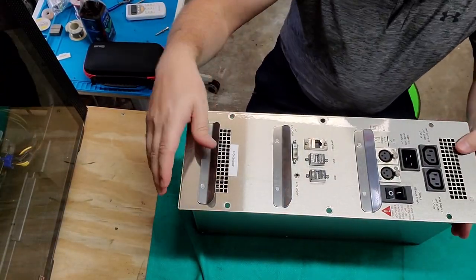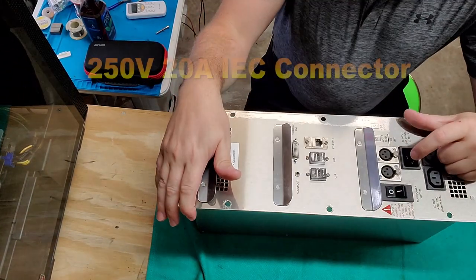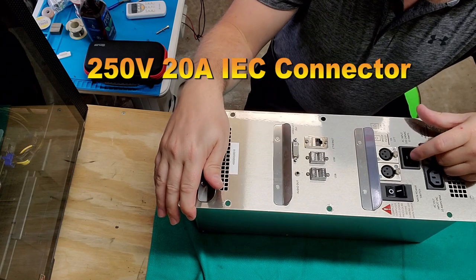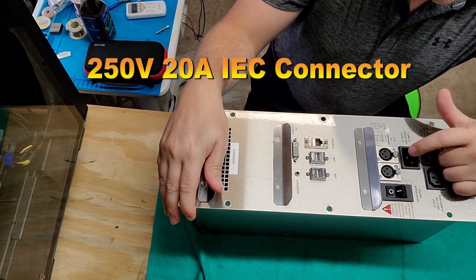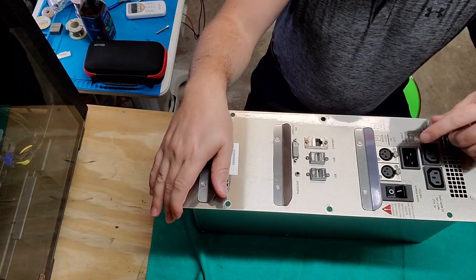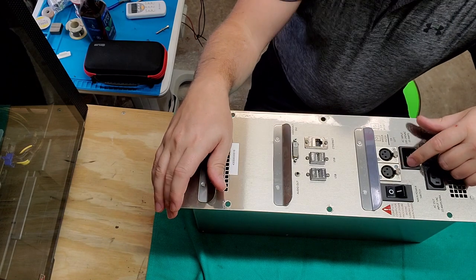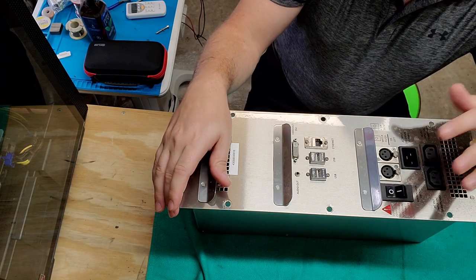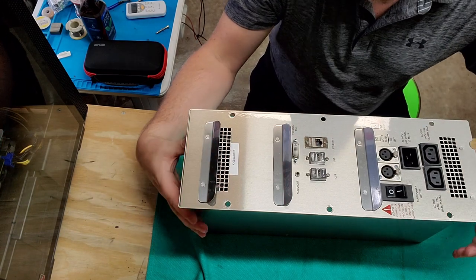So let's take a look. I have a 20 amp IEC inlet right here. This is for 100 to 240 volts. It says 10 amp, but you can clearly see that they used a 20 amp receptacle here. So we're gonna have to go ahead and jumper that guy with some banana clips to get this guy up and going. I don't believe I have a 20 amp IEC cord around here.